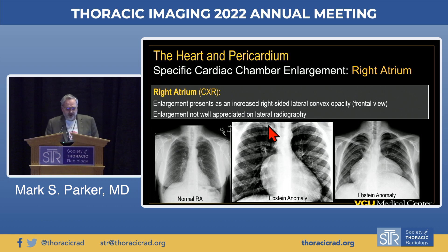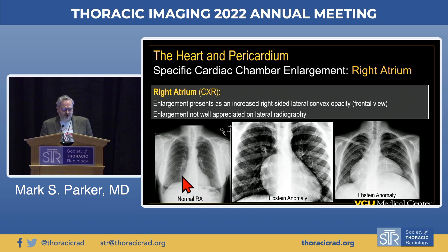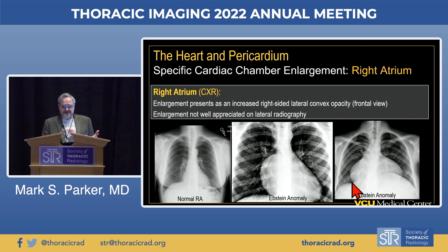With right atrial enlargement, the normal right heart border becomes outwardly and more laterally convex, as classically seen in patients with Ebstein's anomaly, but it may also be seen in other forms of right heart disease and tricuspid disease. On the lateral examination, this is not well appreciated due to superimposition of the cardiac chambers.